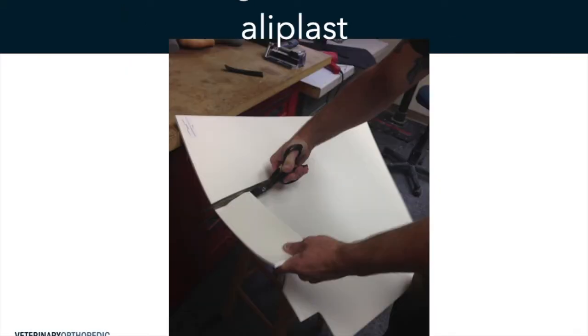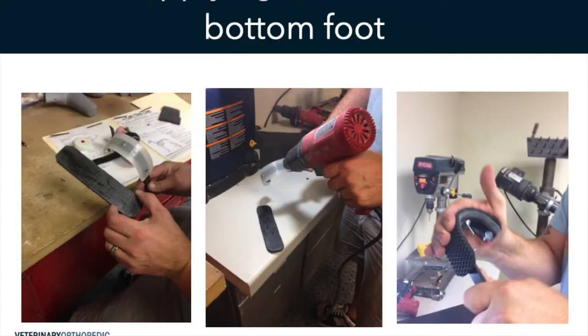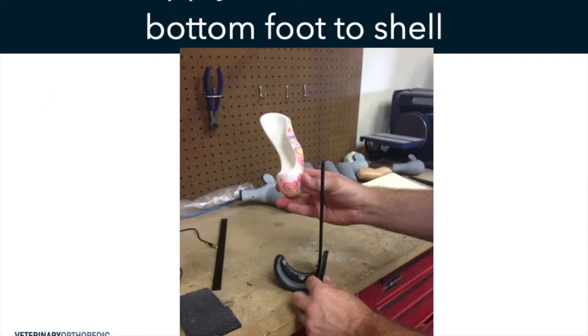So then you're going to cut the foam interface, and you're going to apply the tread to the rocker bottom of the foot. Okay, so now we're talking about the portion that they actually walk on. Okay, so this is what they call the rocker bottom. You can see there's little kind of grips on the bottom of that foot as well.